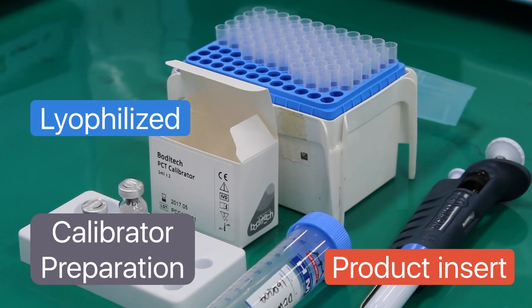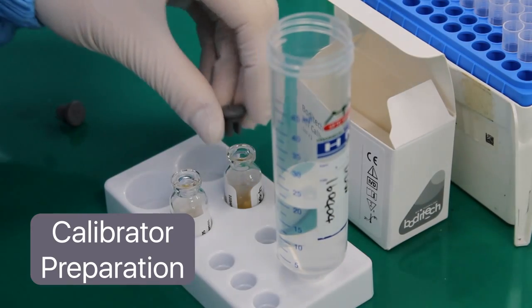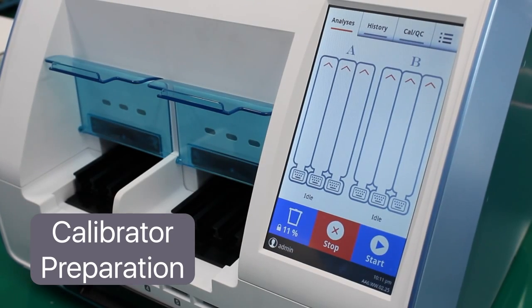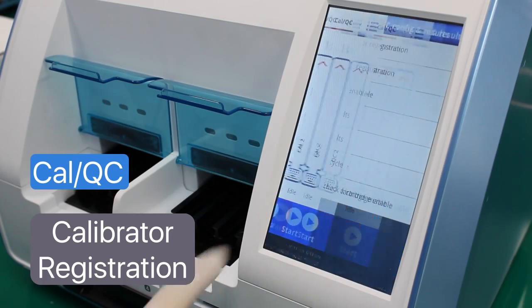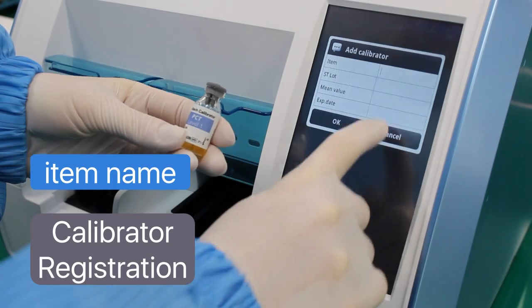Reconstitute the calibrator following the preparation instructions on the product insert. On the CalQC settings menu, press Calibrator Registration. Press the plus icon at the upper right side of the screen to add and register.